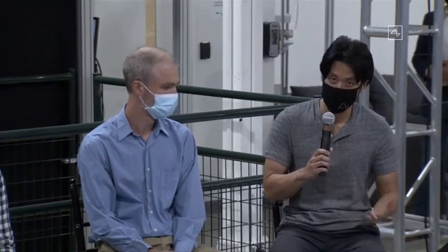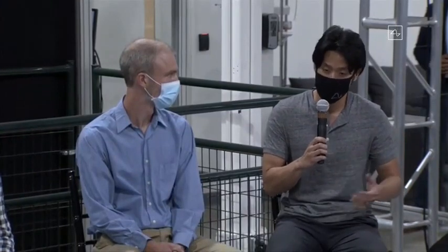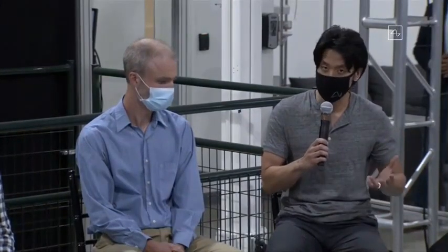So first and foremost, privacy and security are top priorities at Neuralink, especially given the sensitivity of the data that we're collecting. One of the things that we're ensuring is that a lot of the interactions with the brain data are encrypted and authenticated properly. We work on every layer of the product, from chip design to source code, and it really gives us a unique opportunity to embed security as part of our design from the get-go, and to make sure that there are no single points of failure.